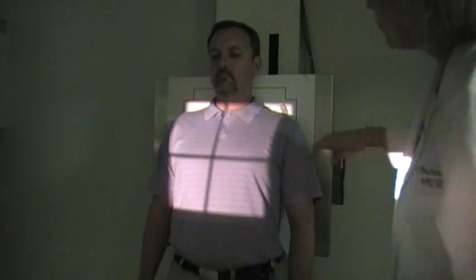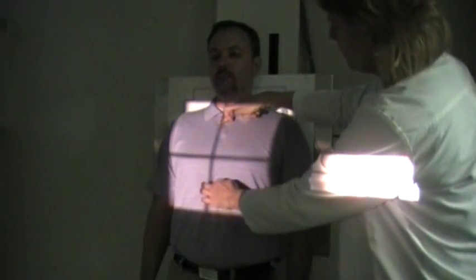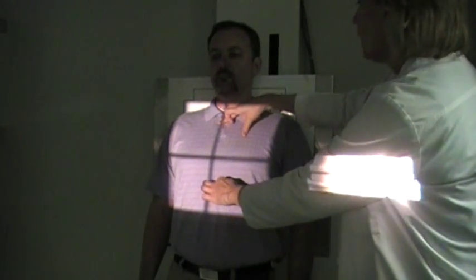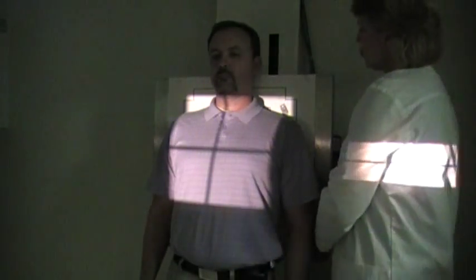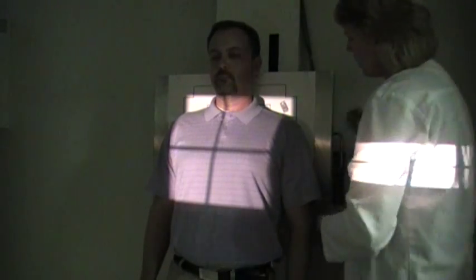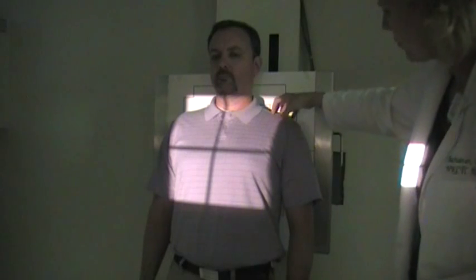So your central ray is going to hit midway between the jugular notch and the xiphoid. So I can actually come a little bit higher. Okay, and then I'm going to adjust my bucky tray to accommodate that. So again, place your marker on here. This is the left side. So this is our lordotic chest.